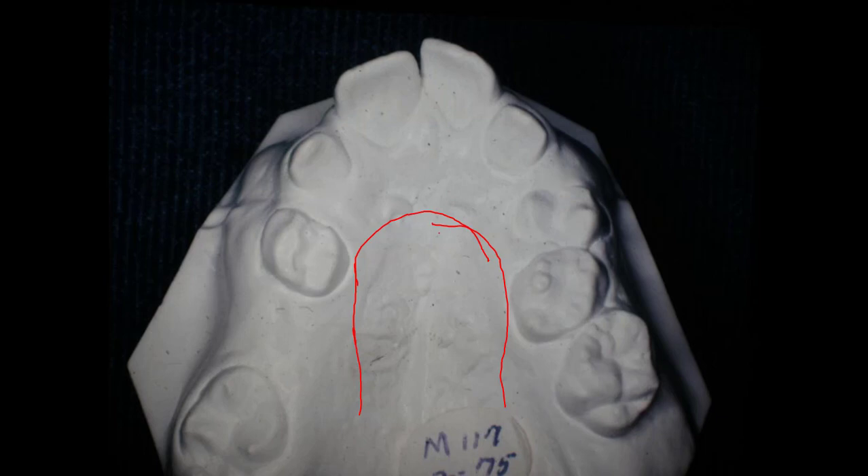That's my little finger on my left hand, and the finger was right about there. Then you'll have to look at the next picture, which will be after we separated the palate.